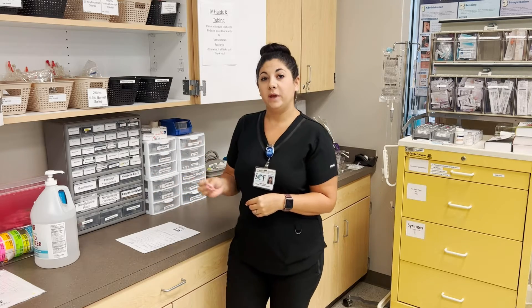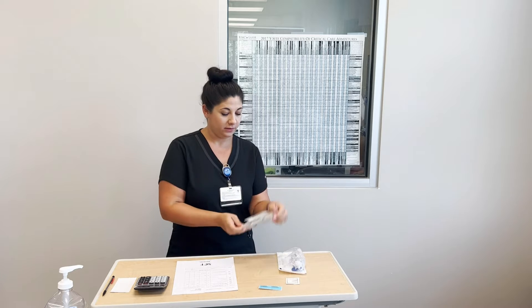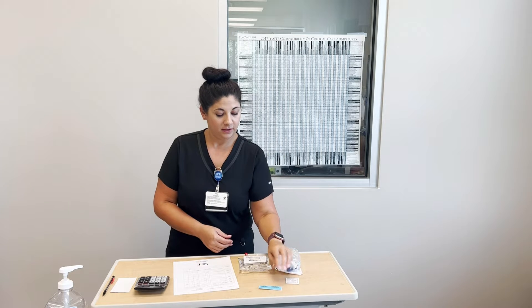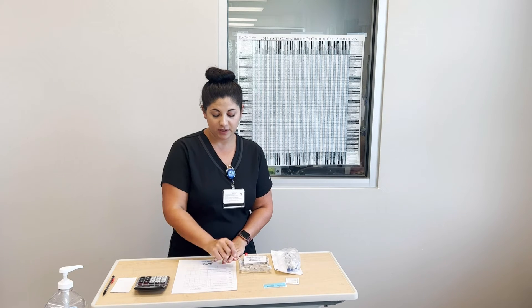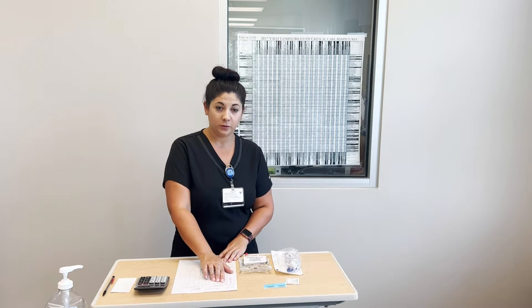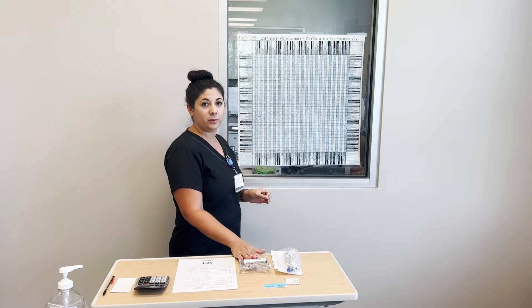Once I have pulled all of my medications, I will grab any supplies that I need. I have already done my first check on my IV piggyback medication. I have gathered my supplies: my medication, secondary tubing, an alcohol pad, and a label. I'm going to check my MAR, looking at my patient's name and date of birth, and verifying allergies. I am looking at their primary fluids that are ordered and going to use my chart to check compatibility against my IV piggyback medication.